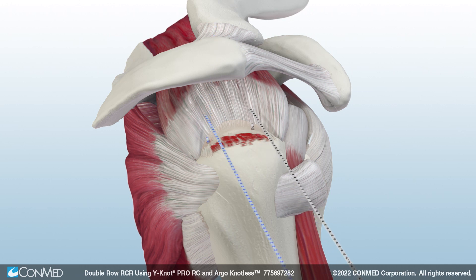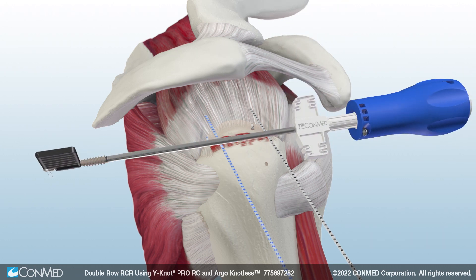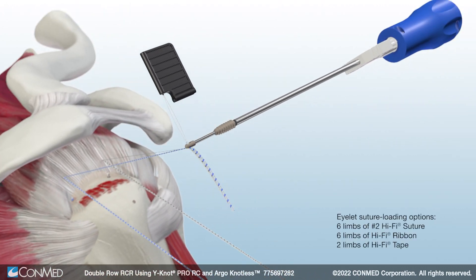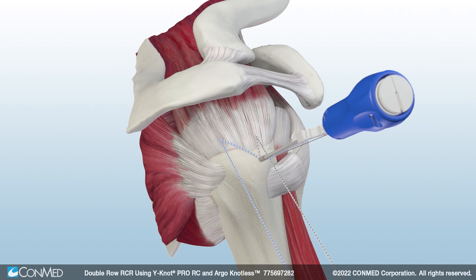For lateral row fixation, first insert the Argo-Knotless broaching punch into the anterior lateral insertion site and punch to the appropriate depth noted by the laser line. Then load one Hi-Fi Ribbon from each medial row anchor into the threader tab of the Argo-Knotless anchor. Insert the nose of the eyelet into the pilot hole and set tension as needed by individually pulling and cleating each suture limb onto the white suture cleat while applying counterpressure to the back of the driver handle. Then hold the white cleat stationary and turn the blue handle clockwise to insert the anchor to the depth mark.